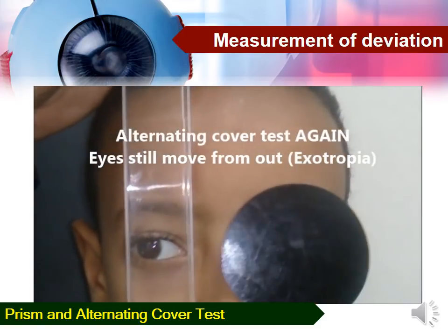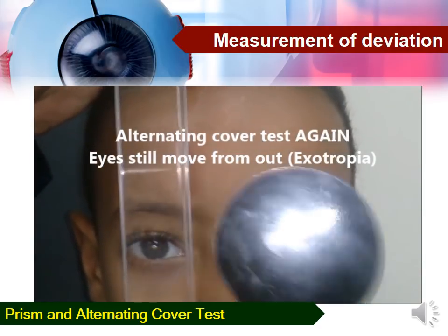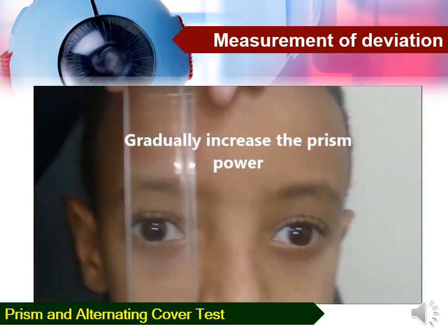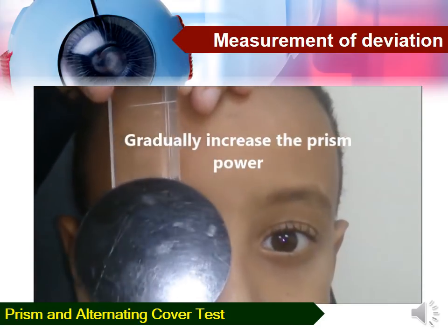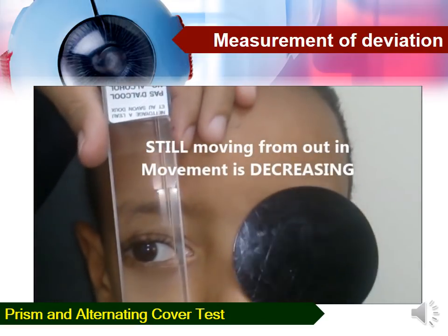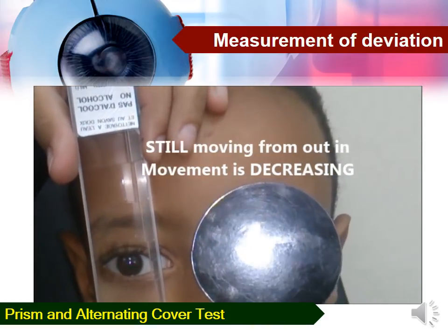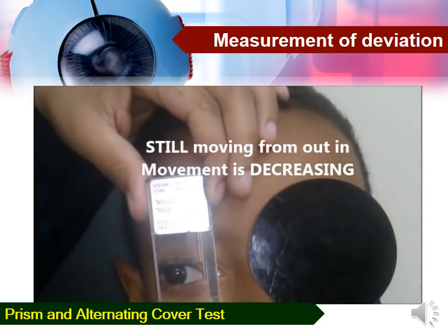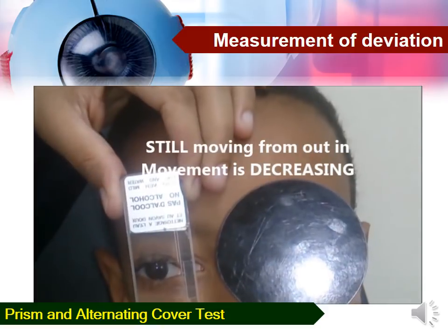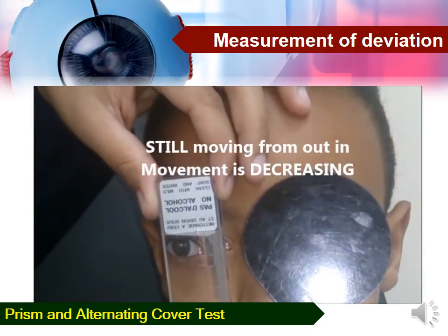So now we have to place a base-in prism in front of one eye, and we do the alternating cover test. The eye is still moving from out in, so we gradually increase the prism power until the movement stops. You can notice that the movement is decreasing as we increase the prism power. But even with the largest prism in the prism bar, there is still movement of the eye from out in.